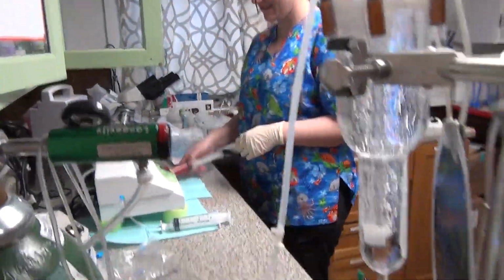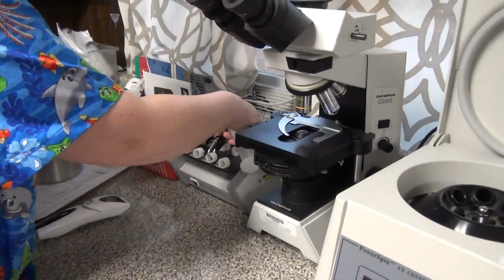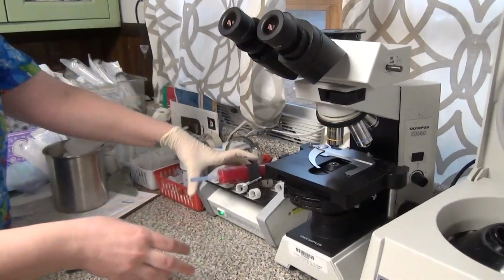You're going to put it on the rocker for a little bit, or show how we do that. That's something that's great to have, but not necessary. It's definitely good if you have more than one person using it at the same time. Yeah. Multiple doctor appointments. Right, that's good.